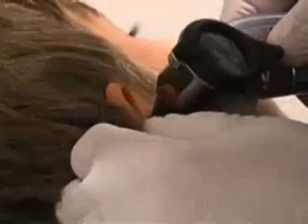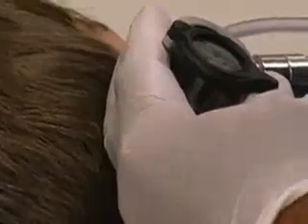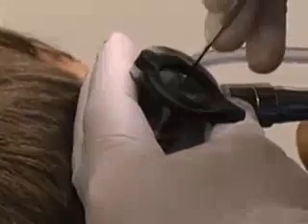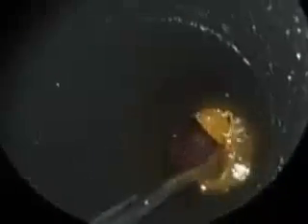With the child fully immobilized, and with the child's head secured by an assistant, insert the otoscope into the external auditory canal using your dominant hand. Once in the proper position, use your non-dominant hand to hold the otoscope in place. Partially displace the lens of the otoscope and insert the blunt ear curette into the speculum. Under direct visualization, advance the loop of the curette behind the piece of cerumen.